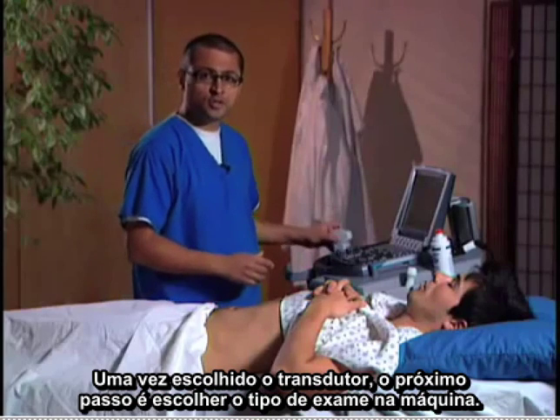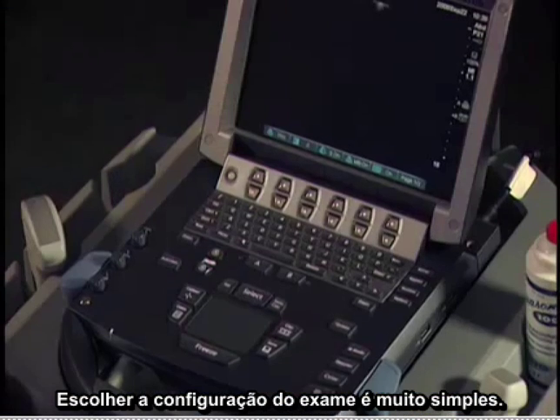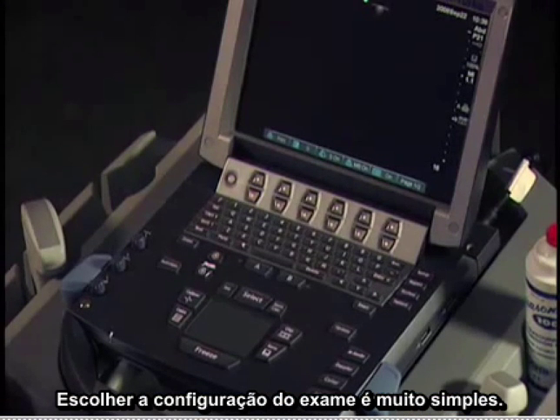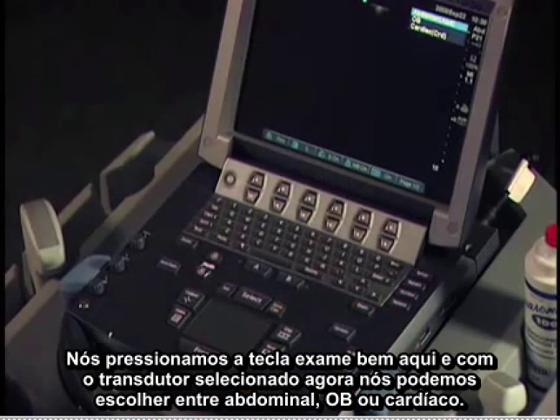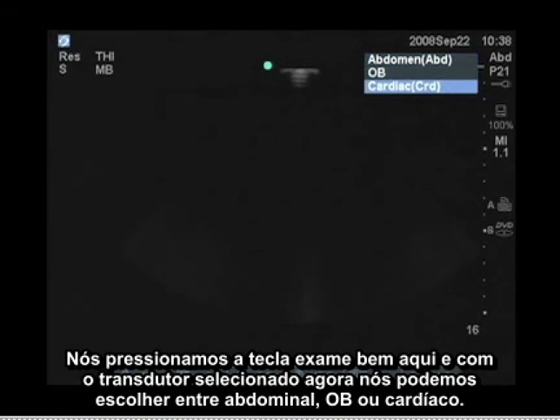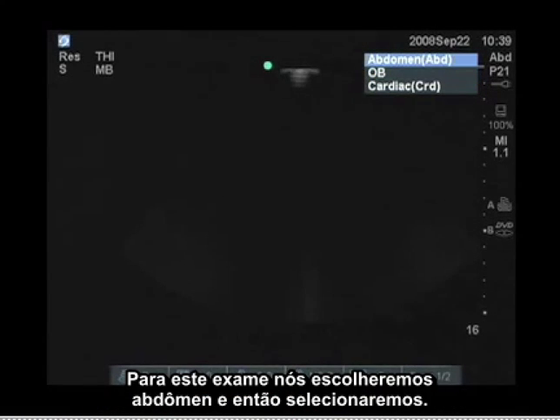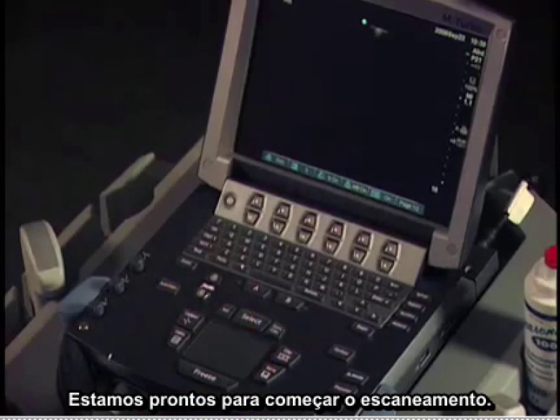Once you've chosen the transducer, the next step is to choose the exam type on the machine. To choose the examination configuration, it's very straightforward. We hit the exam key right here, and with the selected transducer right now, we can choose between abdominal, OB, or cardiac. For this exam, we're going to choose abdomen, so I'm going to hit select, and we're going to be ready to start scanning.